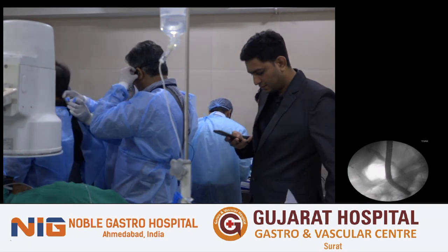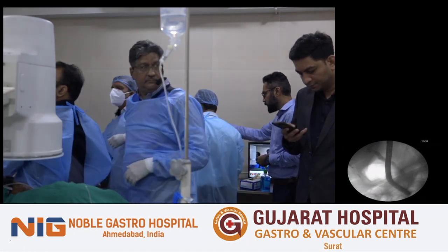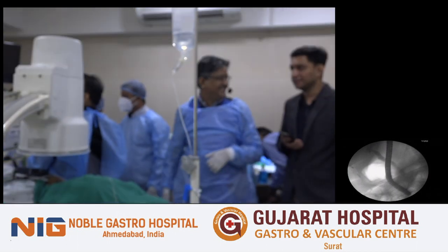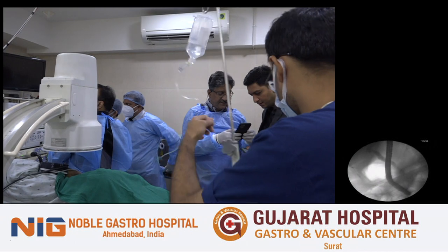As the stone size increases, there is a higher chance of hemorrhage, pancreatitis, as well as perforation. And when we are using mechanical lithotripsy, there is always a problem of broken basket, traction wire fracture, as well as broken handles. As time has developed, the visualization system has improved, and we can see that the cholangioscope has come as a great boon for ERCP.